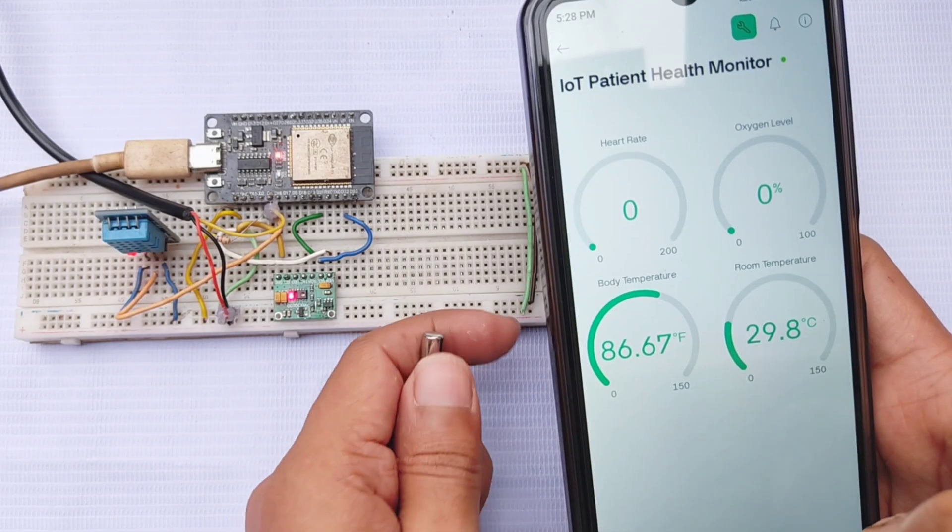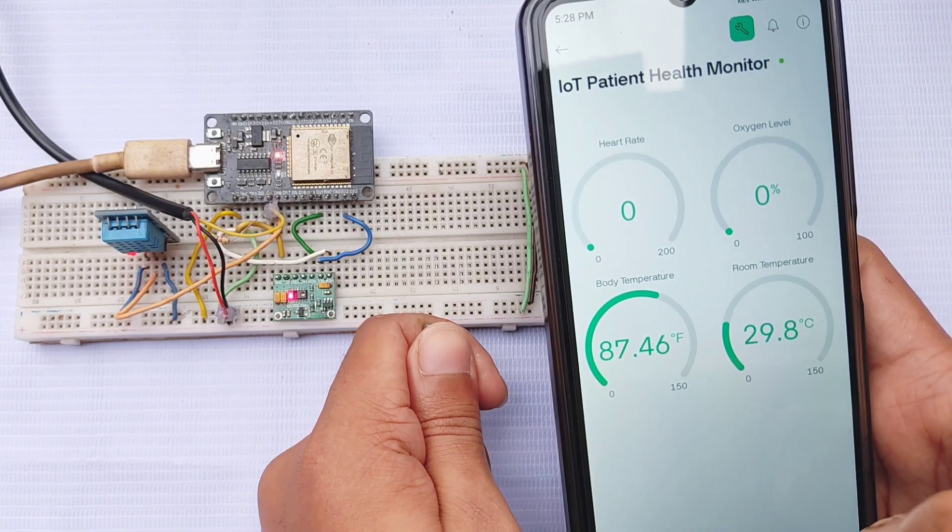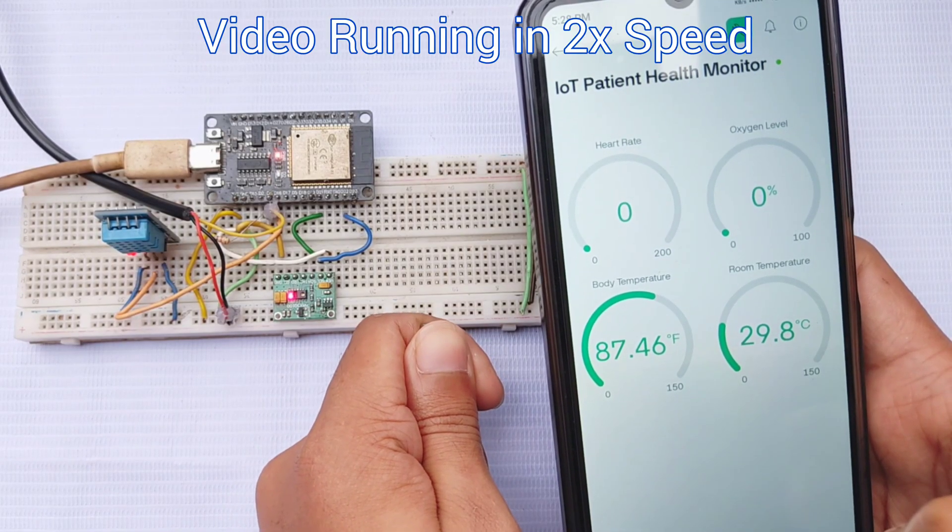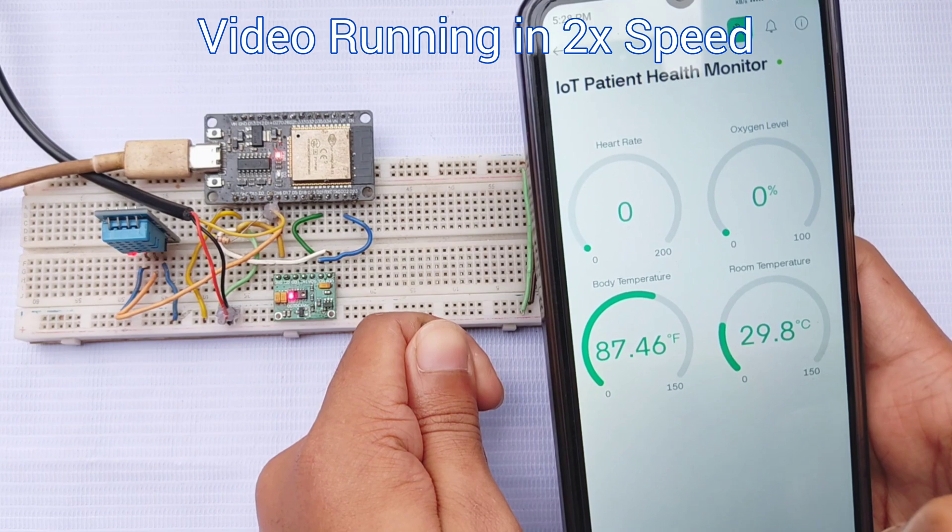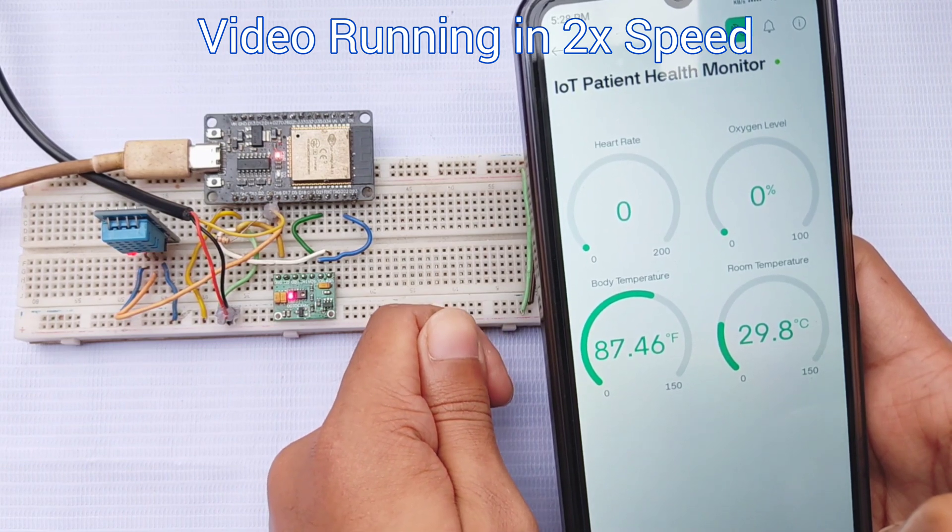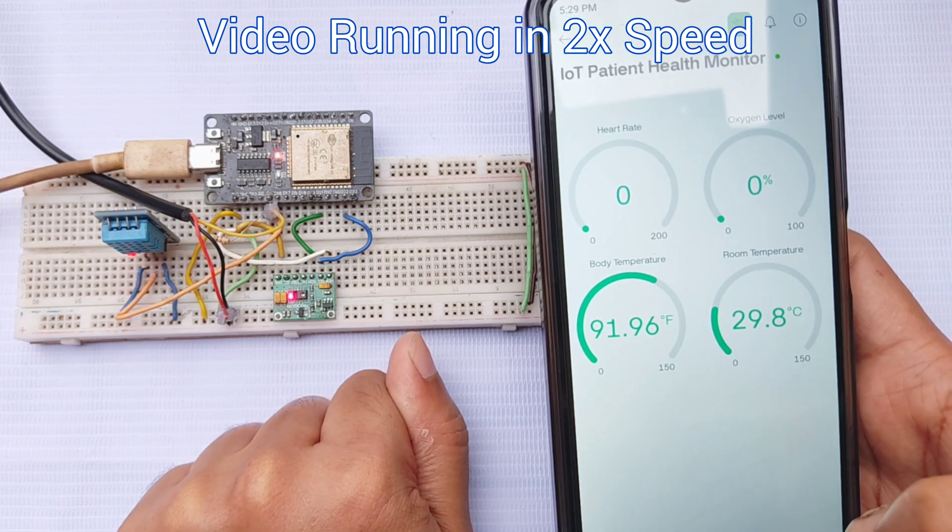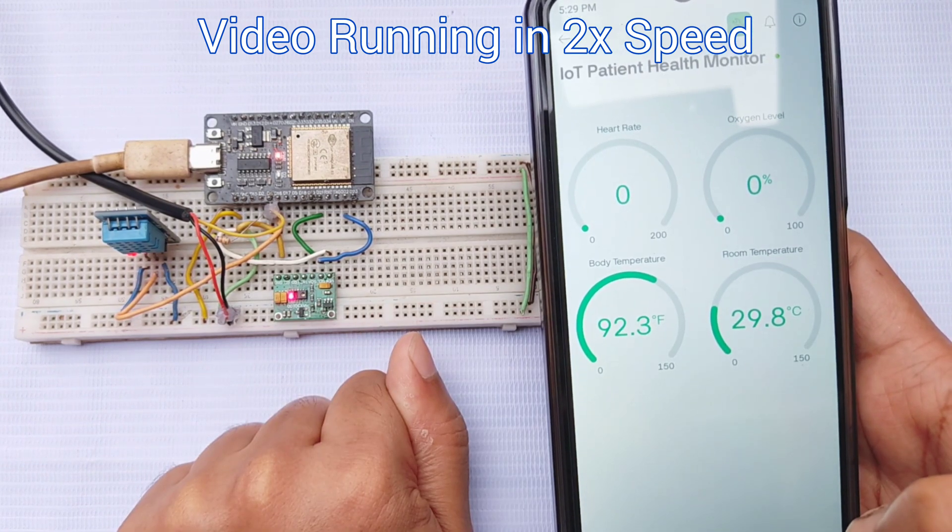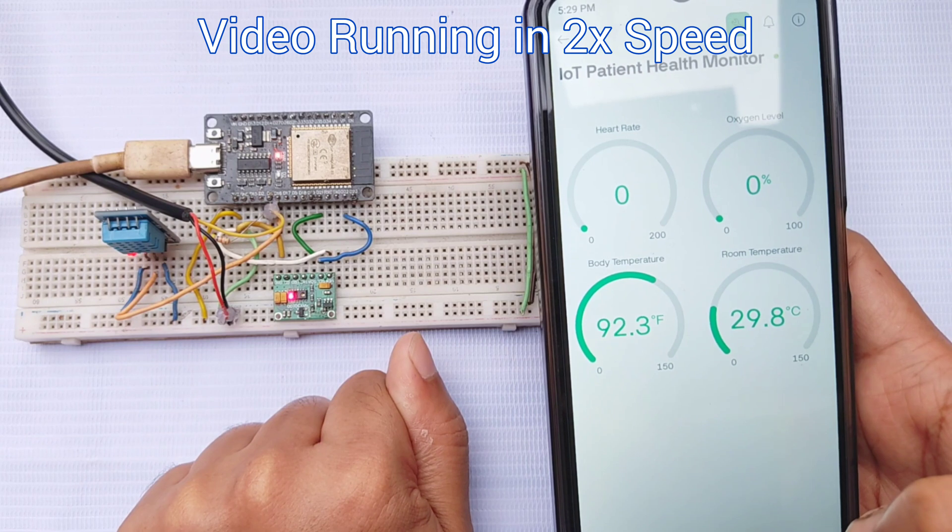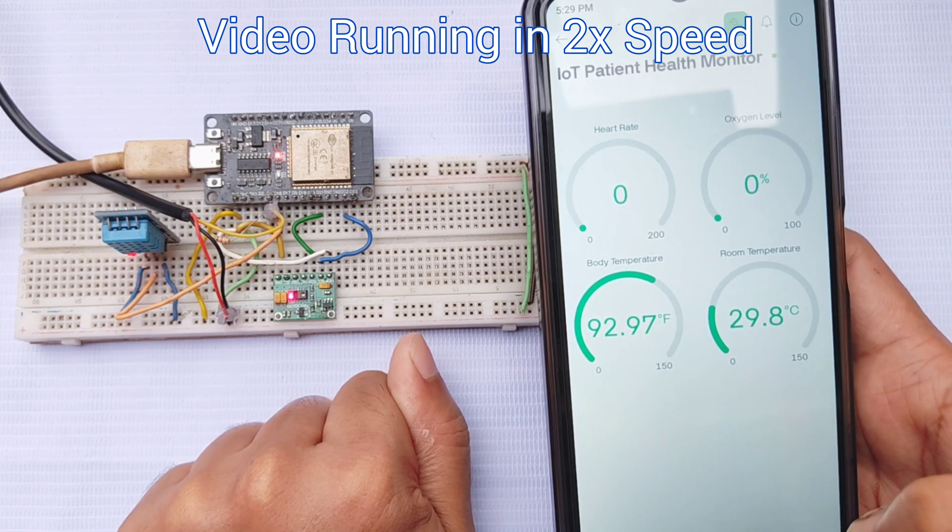You can also observe the body temperature readings from the DS18B20 sensor and the room temperature from the DHT11. I've fast-forwarded a portion of the video to help you see how the body temperature readings change over time.